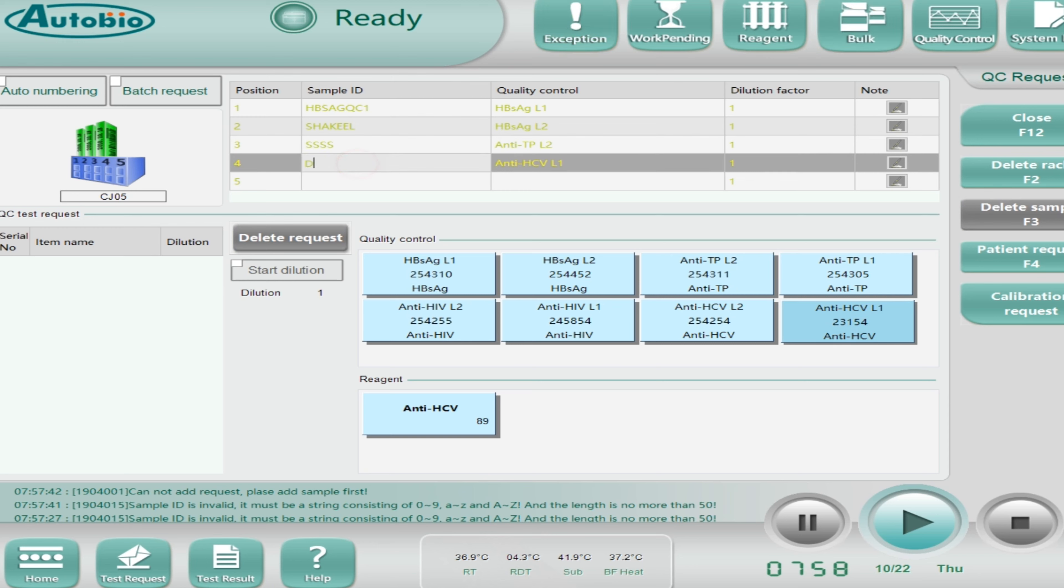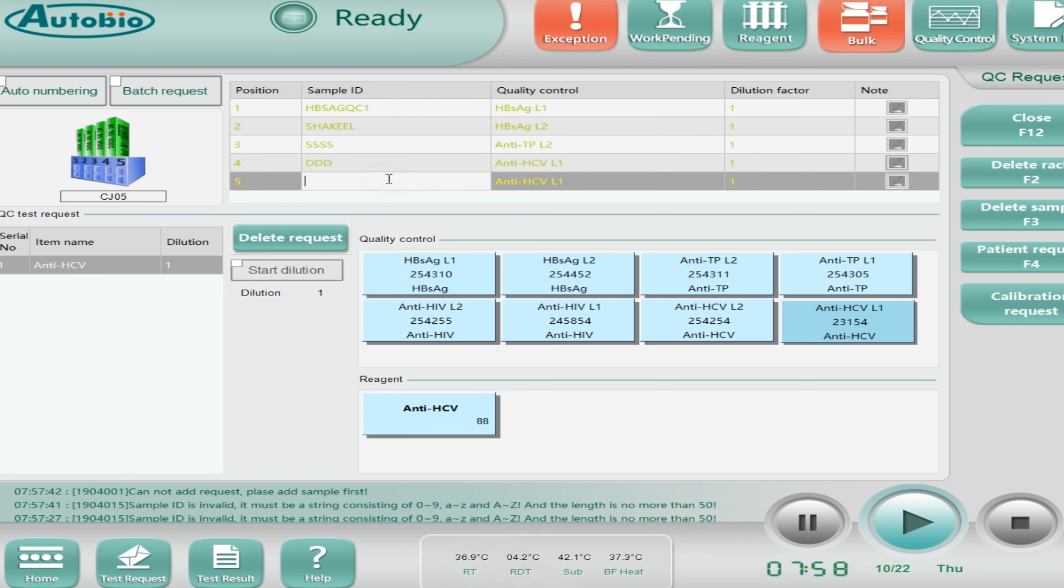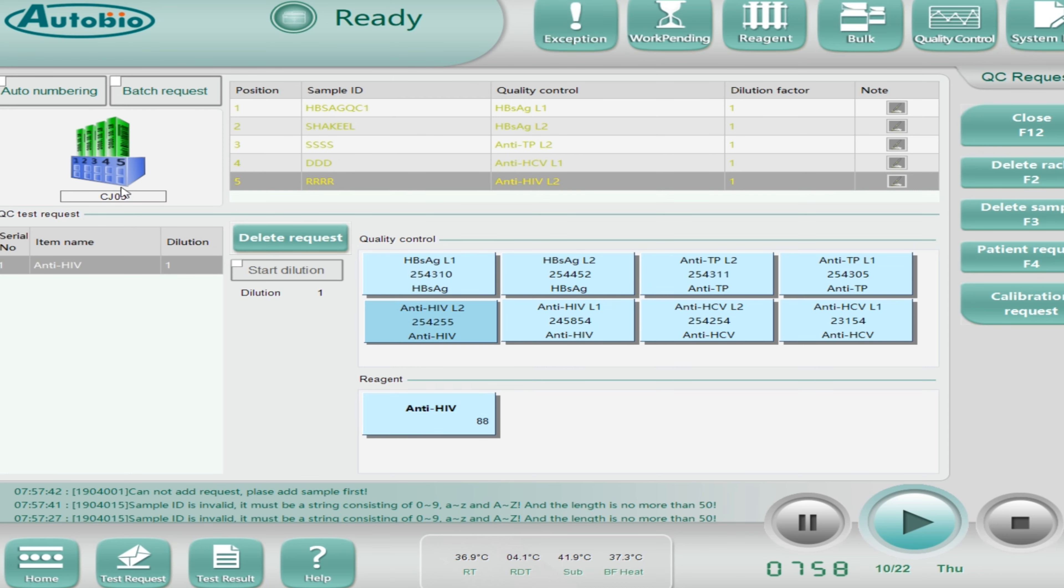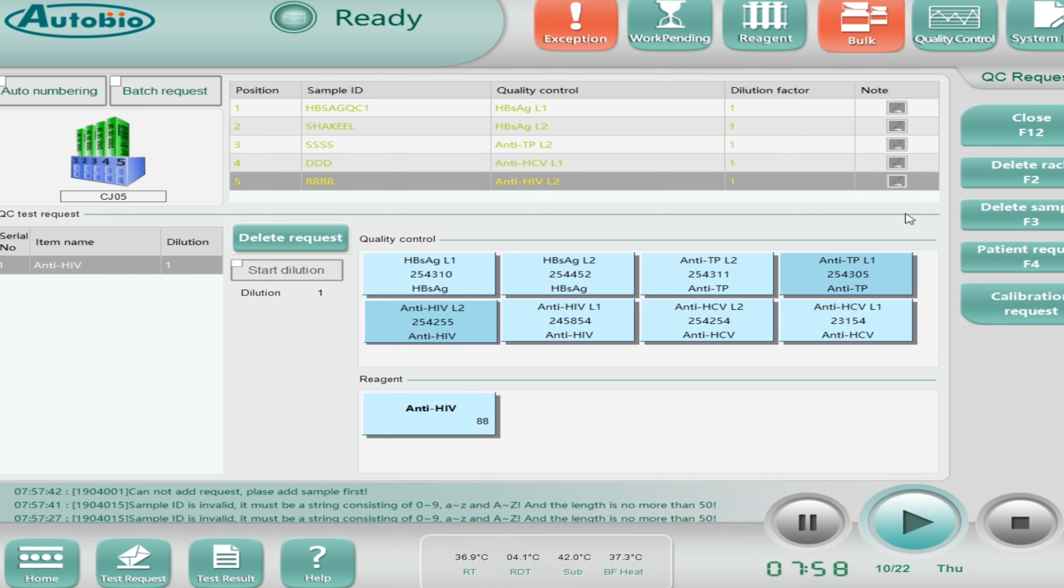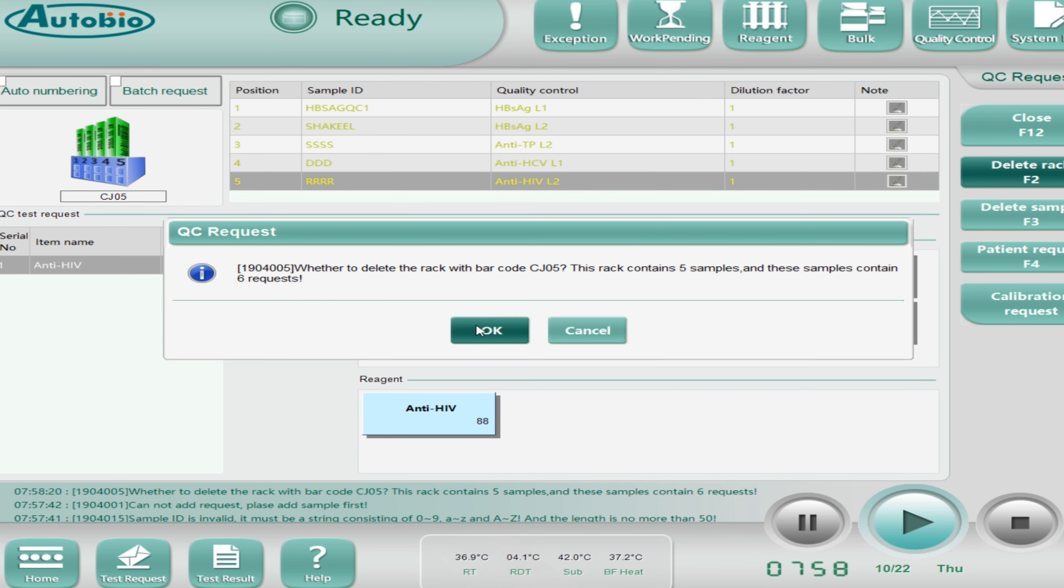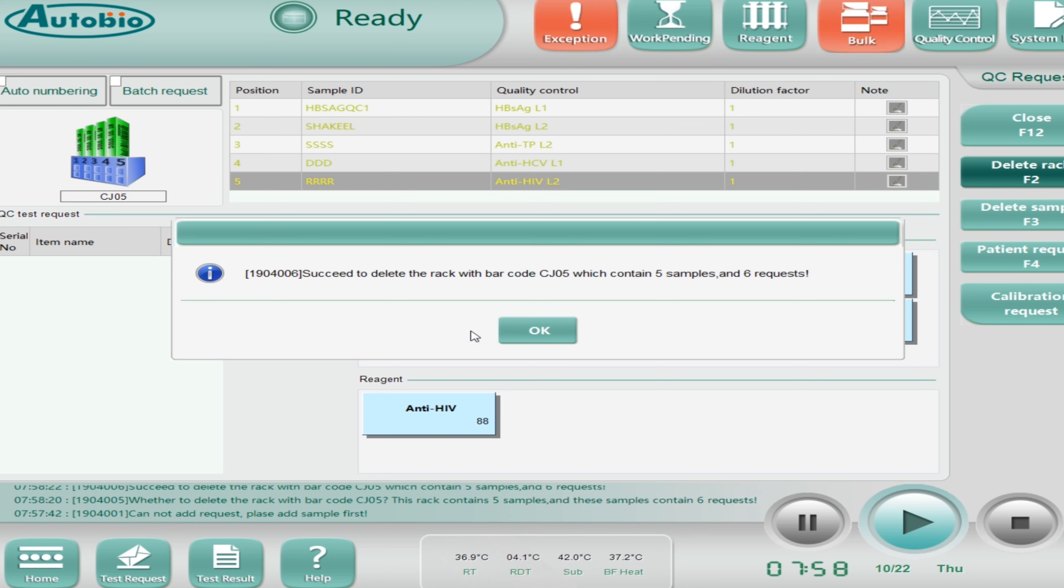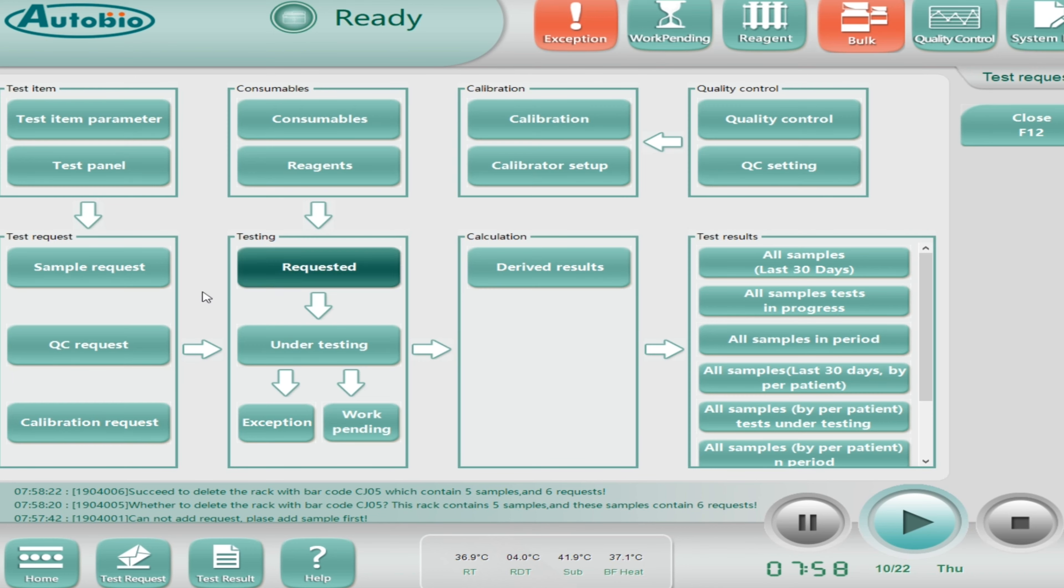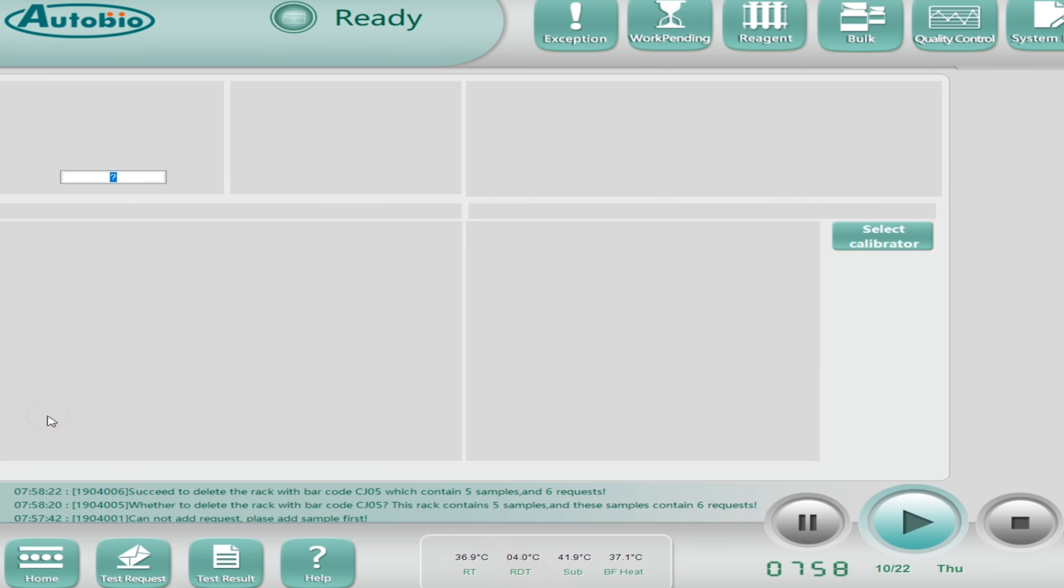Then click on the reagent, then position number two. Again you can select any tests, any QC, and then type the QC ID. Same way, click on the reagent. And it's done.